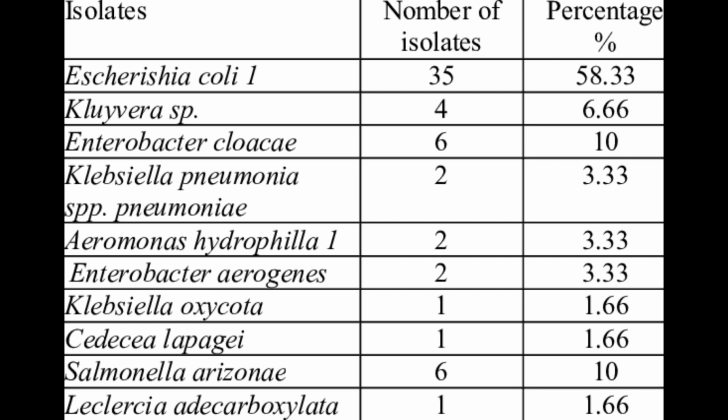That's for red over yellow, actually. Sorry about that, in the deaminase. Now let's go to K over K, which is P over P with H2S production, where LDC is positive and H2S is positive. It's kind of hard actually to understand.